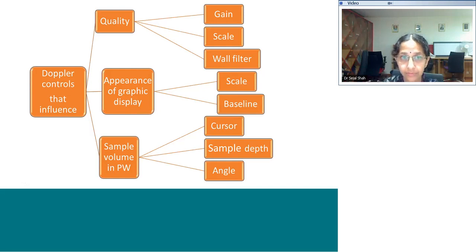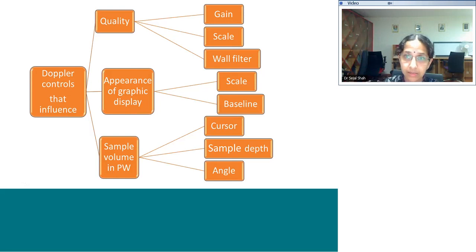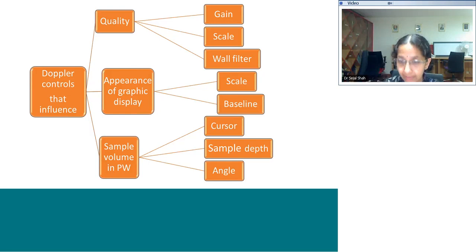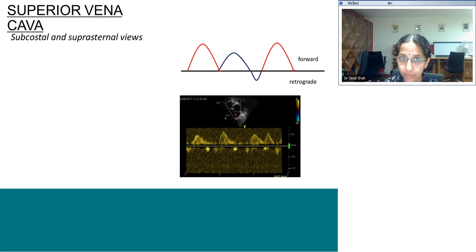The Doppler controls are called gain, scale, and wall filter. The gain makes the image whiter; increasing the scale makes it less white. The appearance of the graphic display can be manipulated by scale and baseline — you can lift the baseline up or down and reduce or increase the scale velocity for an optimal appearance. For pulsed wave, the sample volume depth and angle can be used to optimize the Doppler point. With this basic understanding, we move to individual Dopplers.